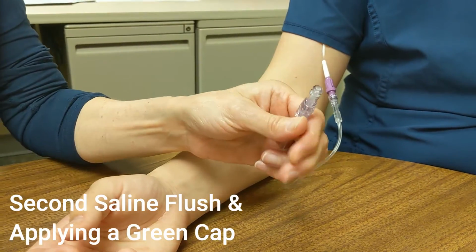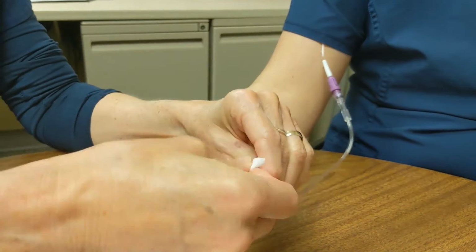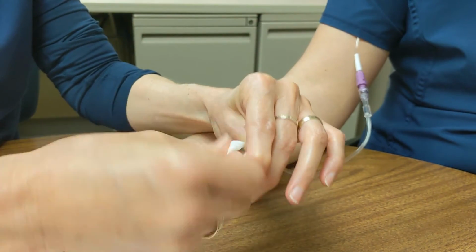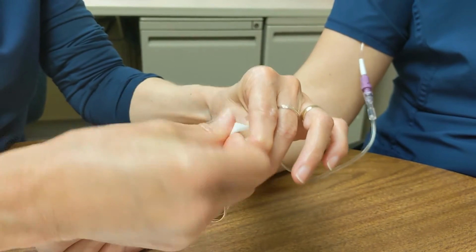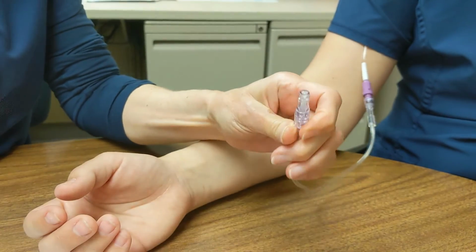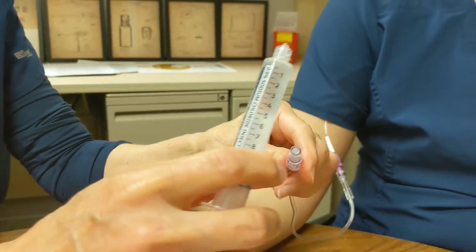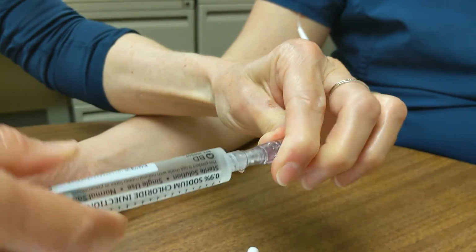Clean the clave connector on the pick with an alcohol swab for 15 seconds. Be careful not to touch the tip of the clave connector with your hands. If you think you may have contaminated the clave connector, go ahead and clean with a second alcohol swab. Carefully remove the white cap from your saline syringe. Holding on to the ridged edge of the clave connector, attach the syringe using a push-twist motion.